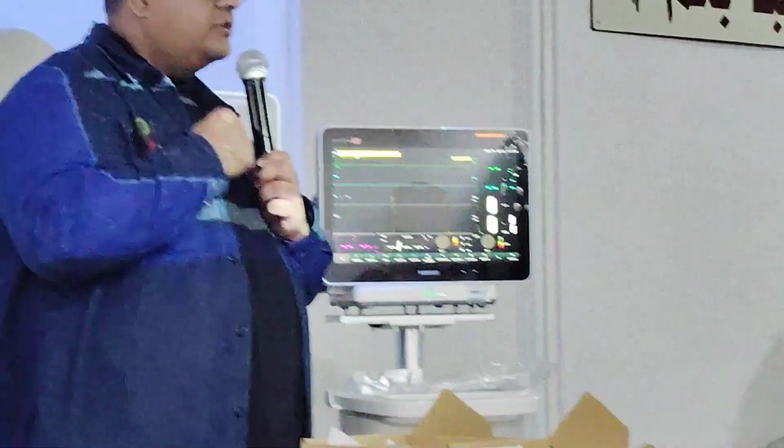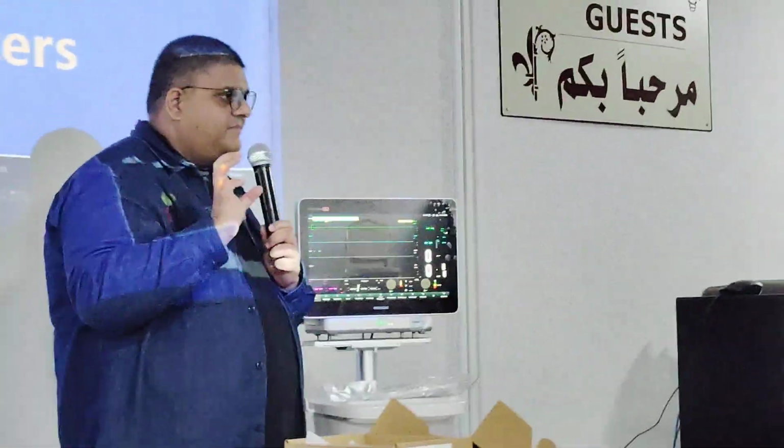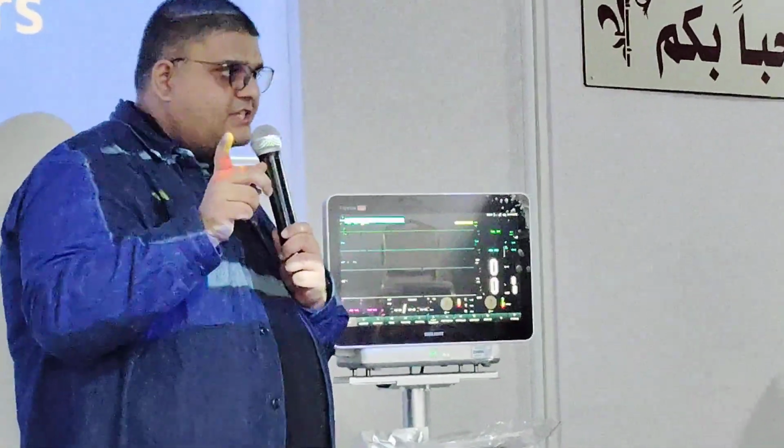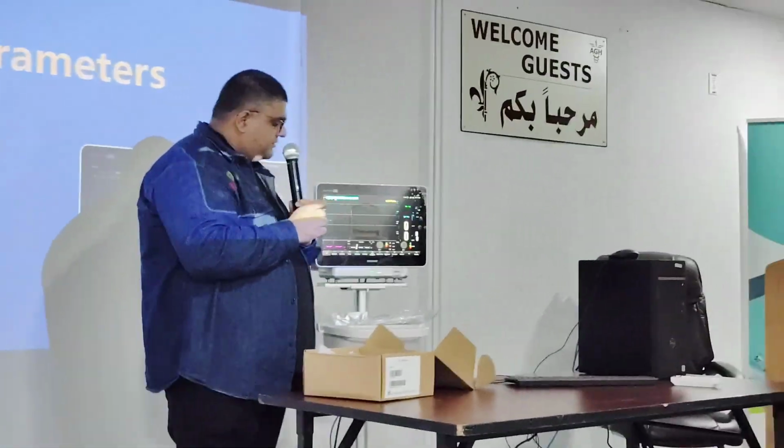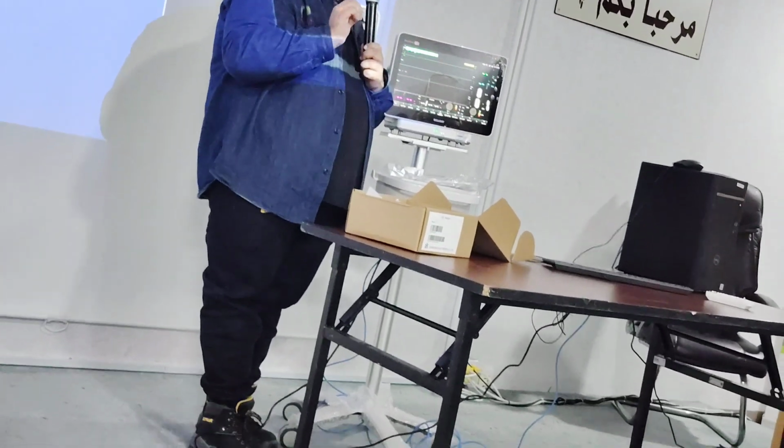Okay, now here's one really important one, which I find, I've been to a lot of hospitals, because you guys don't usually operate the monitor that much. What happens is you don't change the patient type, right? Do you guys change the patient type? Anybody? Do you know how to change the patient type? Don't know. Okay. This is really important.